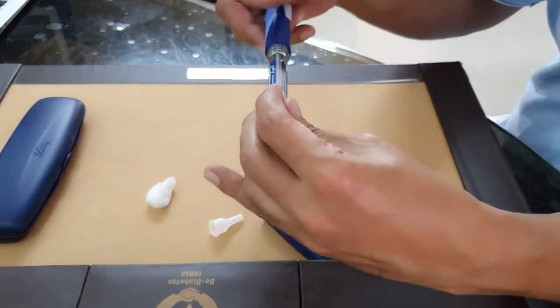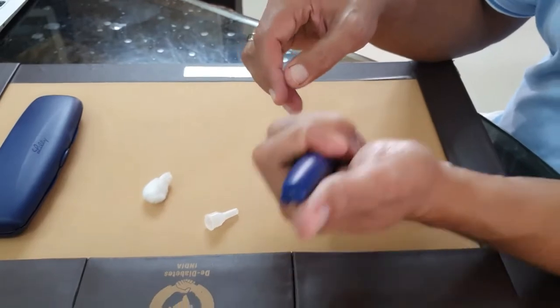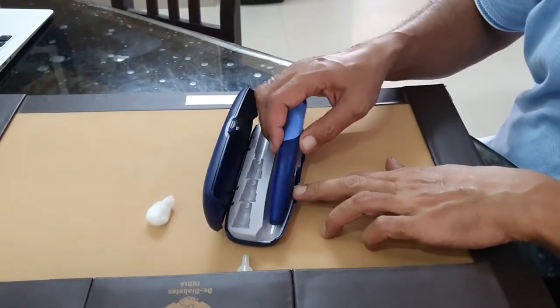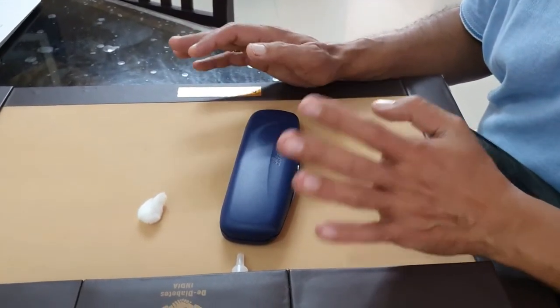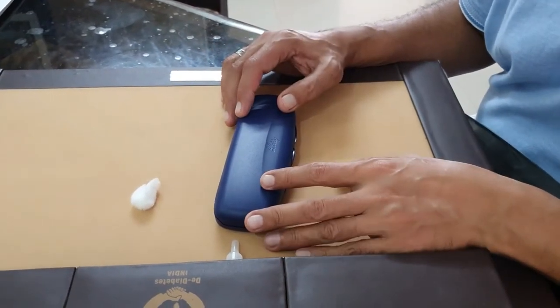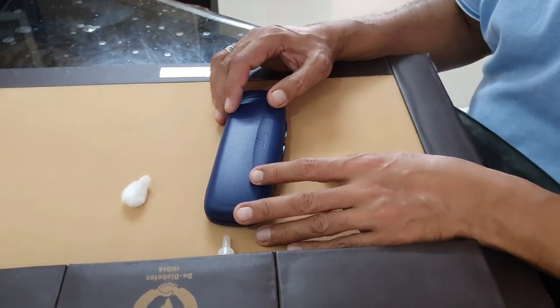After injecting, always keep it safe. Put the cap on. Either you can carry it like this or you can put it in a box like this. You need not keep it in the refrigerator because it is stable at room temperature for one month.